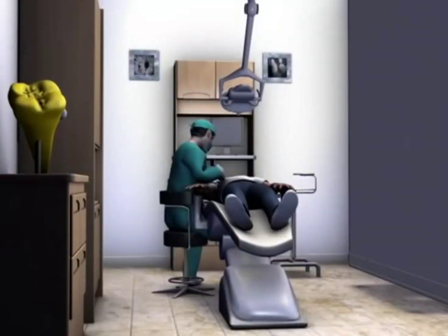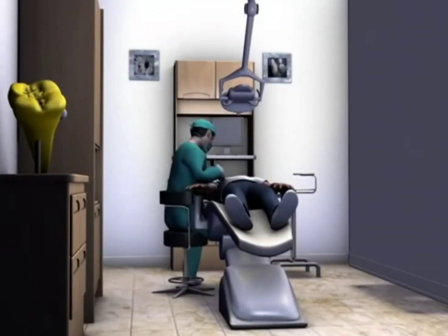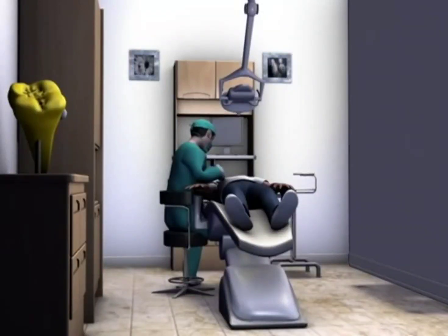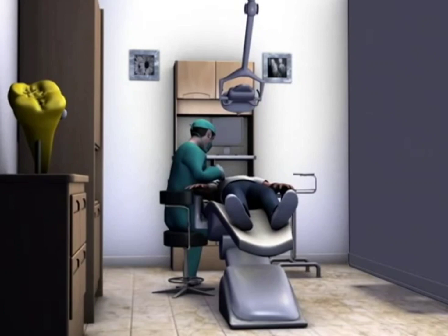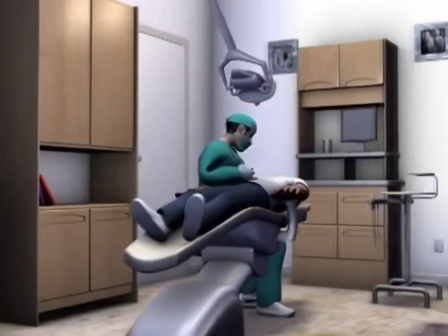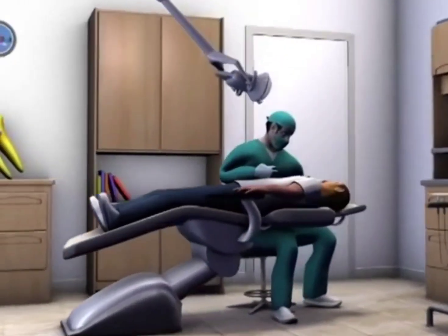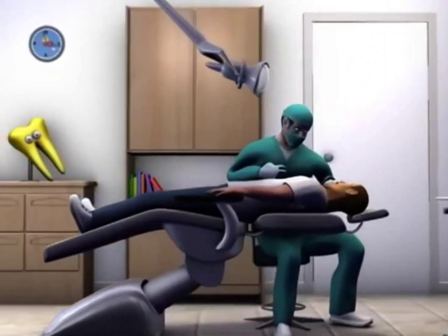A right-handed operator performing an inferior alveolar block injection on the patient's right side is seated at the 8 o'clock position, with the patient reclined in the dental chair to minimize the possibility of syncope.